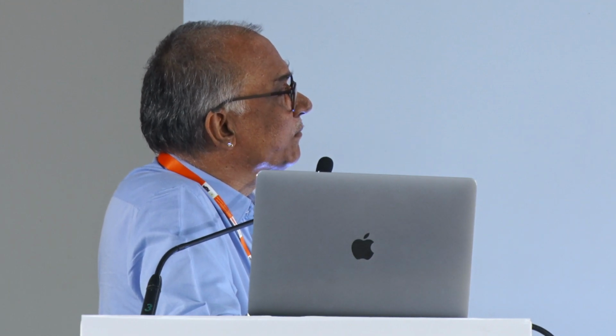Do the ECOM aneurysm. Once you see this and do the study, see, this is how contralateral, ipsilateral, A1, A2, you see that, and then clip it. Again you do ICG, contralateral A2 is not seen. Then you readjust that. This is on table. Readjust the clip and see that the tip is not including, now you can see the tip has excluded that.